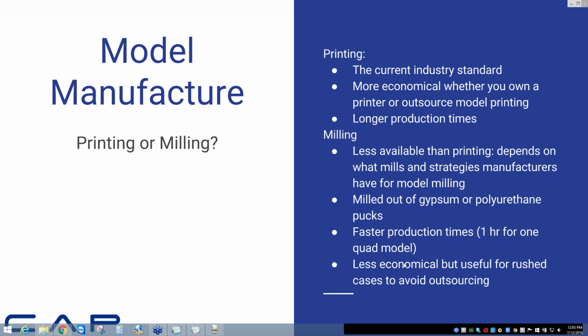For articulator systems, I have a question from Brian. For the articulators that you can choose, there aren't really any other ones that are available from 3Shape to be added, but we have been able to create new model shapes and add them into 3Shape. I haven't heard of a lot of companies adding those into their 3Shape libraries, but it is possible.